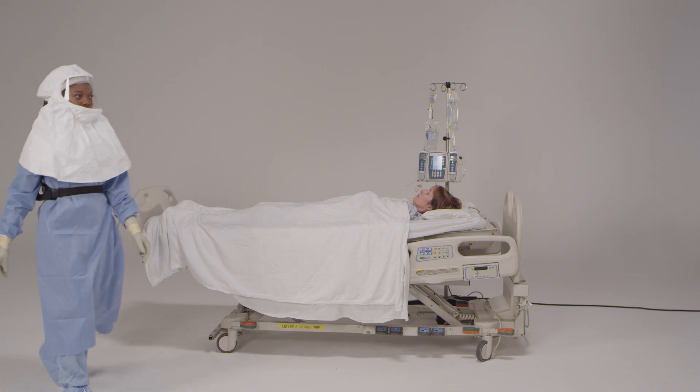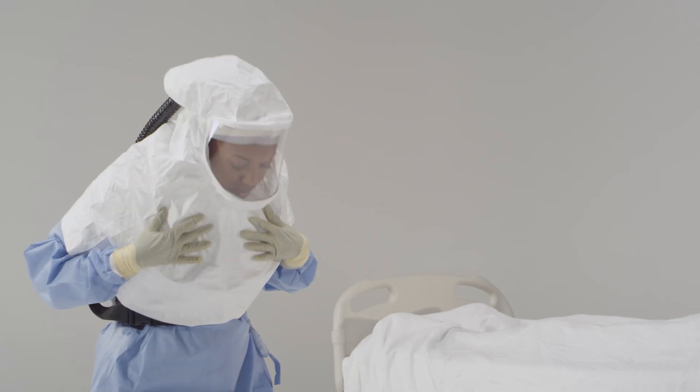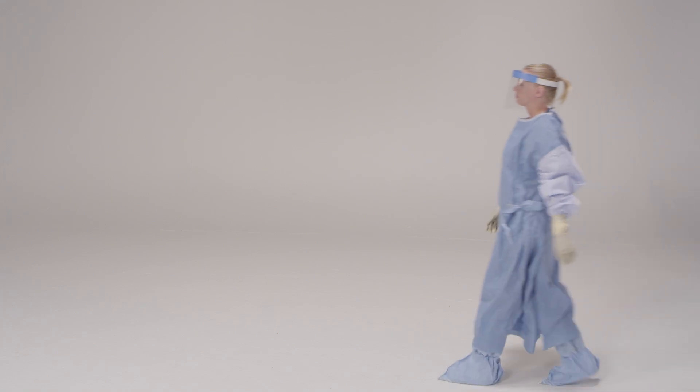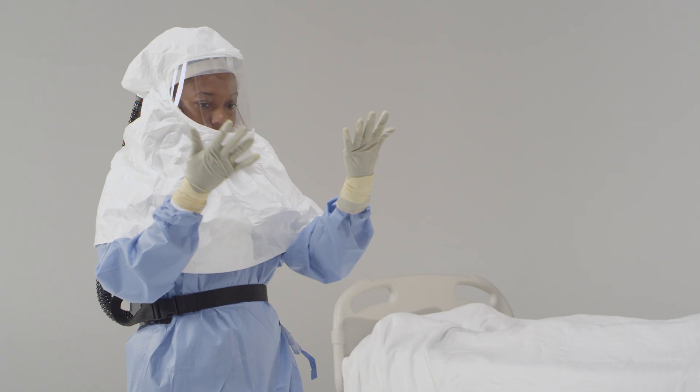Before you move to the patient's room and into the doffing area, you will need to take a few minutes to do some important things. First, get the attention of the trained observer. Once he or she signals to you that it's clear, enter the doffing area. Inspect your personal protective equipment for any obvious signs of contamination or materials on it. If so, disinfect the surface with an EPA-designated disinfectant wipe. Last, disinfect your gloves also with an EPA-designated disinfectant wipe or alcohol-based hand rub.